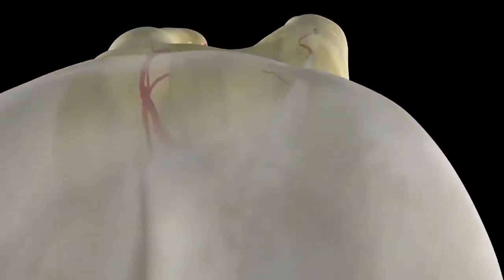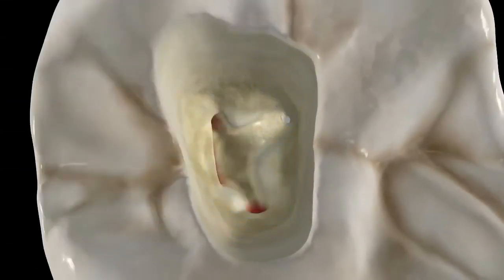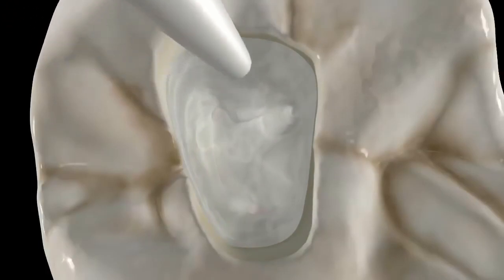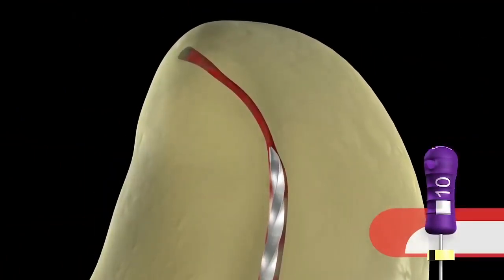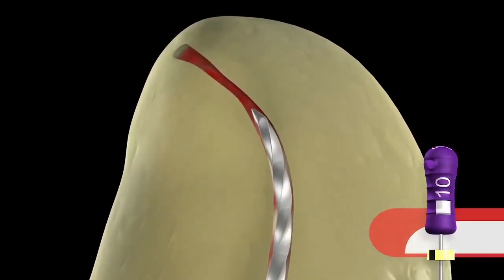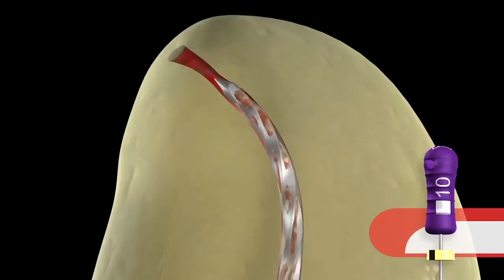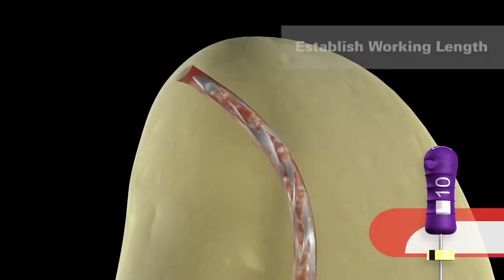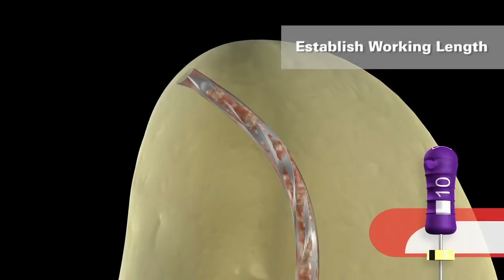We've never been in the apical third, and with an upper two-thirds optimally prepared, let's aspirate out the sodium hypochlorite and return by topping off the pulp chamber with a viscous chelator. Remember, the viscous chelator will be picked up on the file flutes and dragged down into the critical zone. Reciprocate the handle in very short angles, back and forth — that draws the file in. When you see the rubber stop about one or two millimeters off your reference point, stop reciprocating and simply slide. Think of it as baseball — slide in to length.